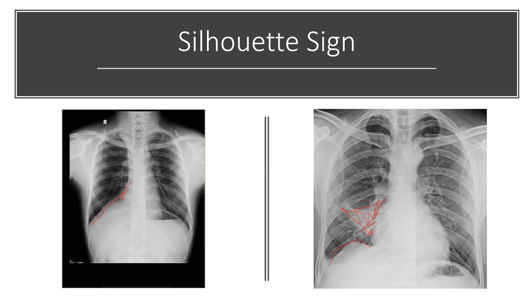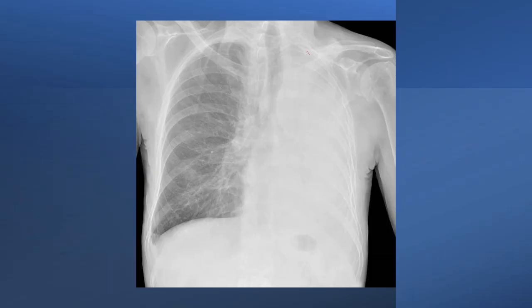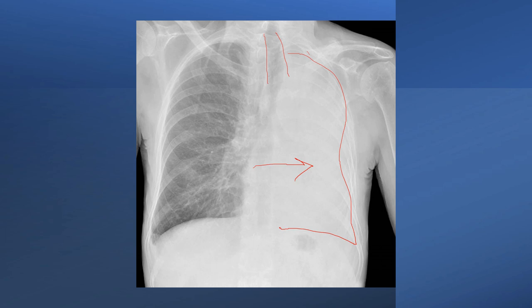By following the silhouette sign, you can localize lesions anatomically. In one example, there is homogeneous opacity on the left side, the heart is pulled towards the left, and there is tracheal deviation to the left — indicating significant volume loss and left lung collapse. If you look carefully, you can sometimes see a bronchus cutoff sign suggestive of a tumor on the left main bronchus.